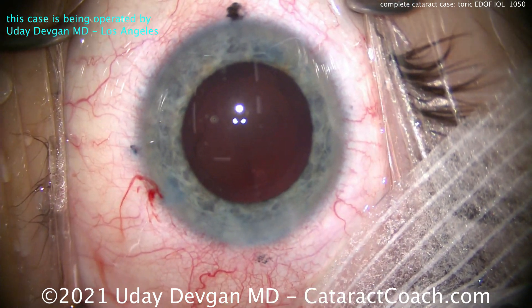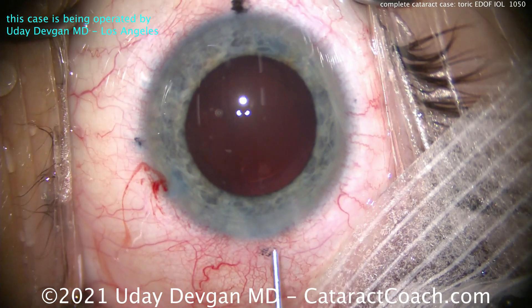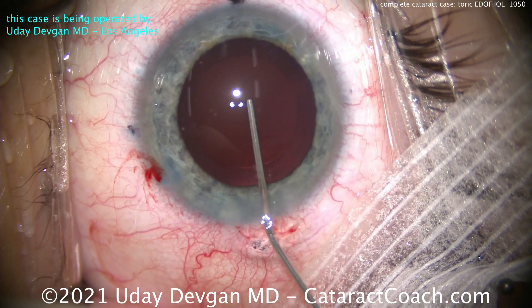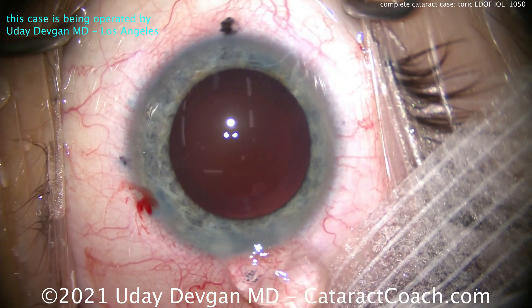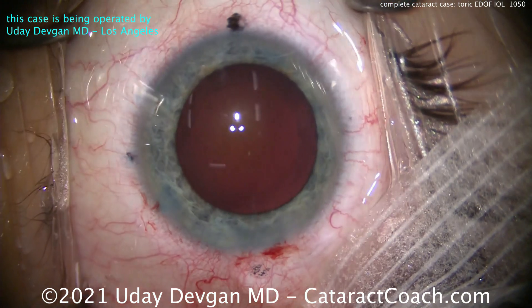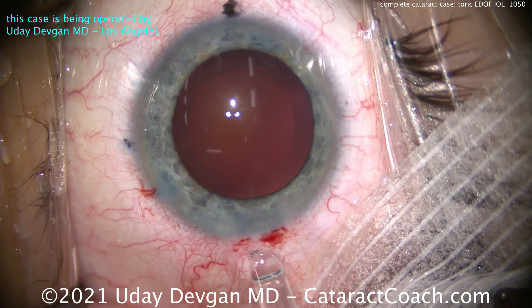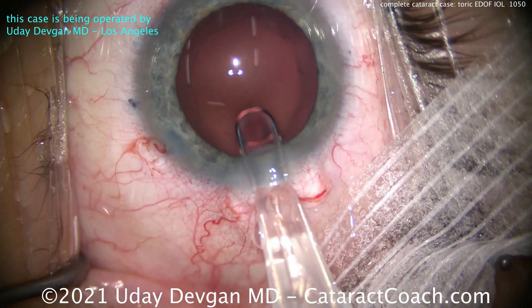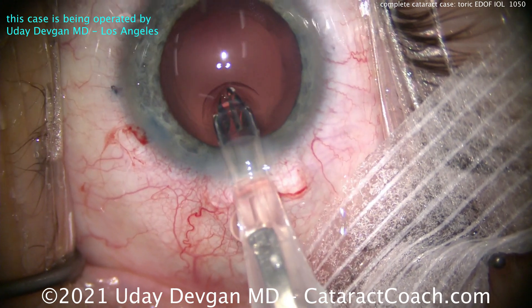Now, here's one of the challenges: this 25-diopter lens that we're putting in this eye is the highest power made for this particular extended depth of focus lens. His other eye, which needs a 29-diopter lens, is going to get a standard monofocal toric lens — not extended depth of focus. Is that okay?